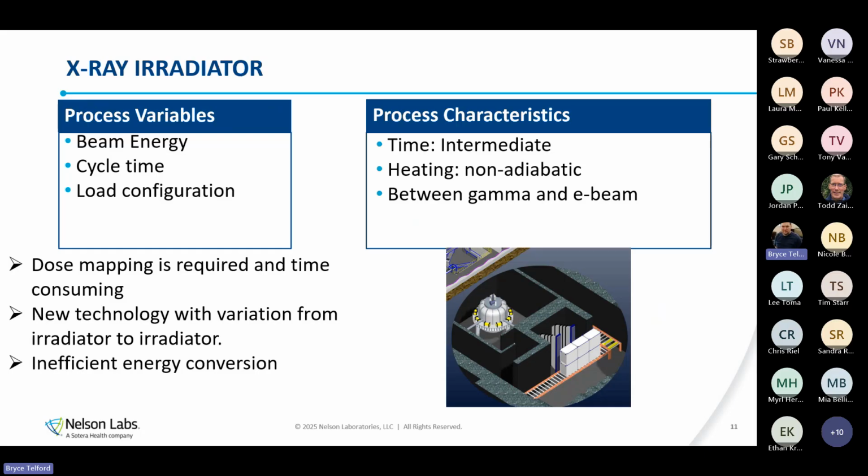Timing tends to be an intermediate between the two, but it does tend to be more on the order of hours and minutes rather than minutes and seconds. Heating, since it is a longer time, does tend to be non-adiabatic because, again, we are pumping energy into the system, but it has time for that to then be released back to the ambient environment. So we generally don't see heating like we do with potentially electron beam.